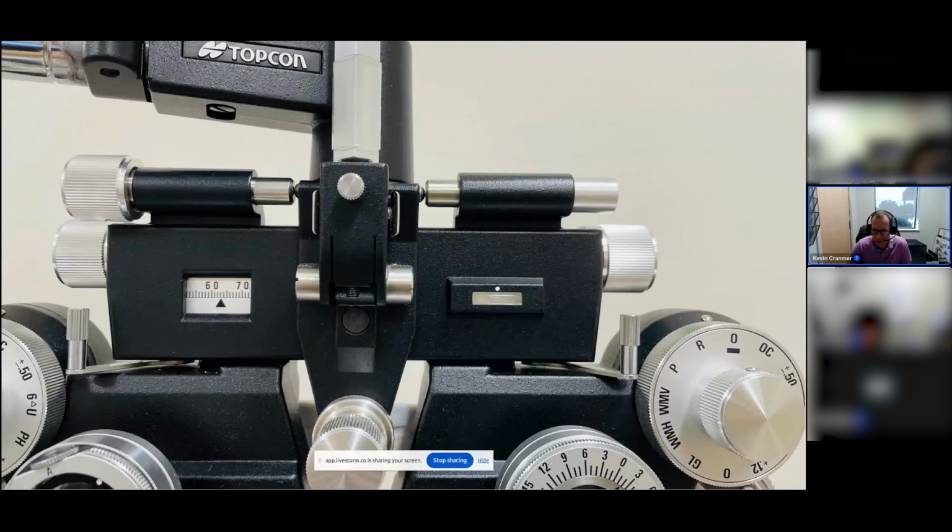Those set the convergence for the phoropter. So it's possible to use this to refract patients for near vision. If your practice does that, when you're checking distance vision, which is the most important part, you should move those to the outer position, which is where they are now.